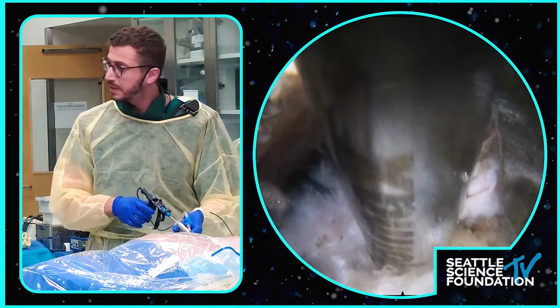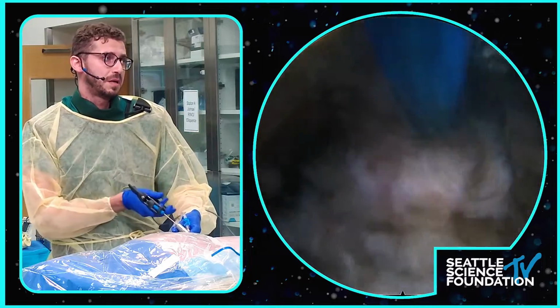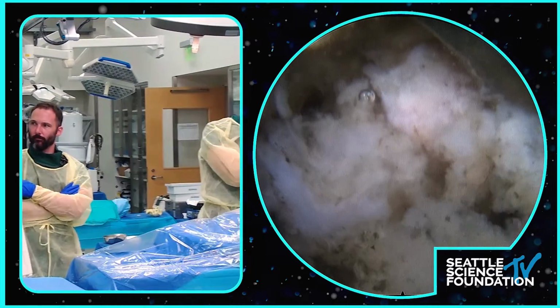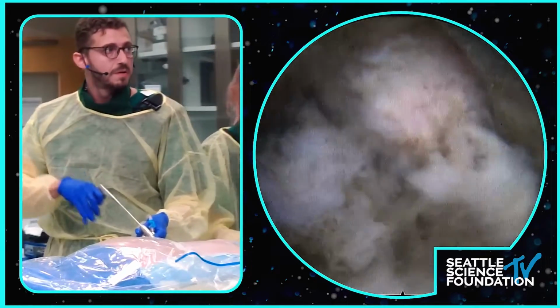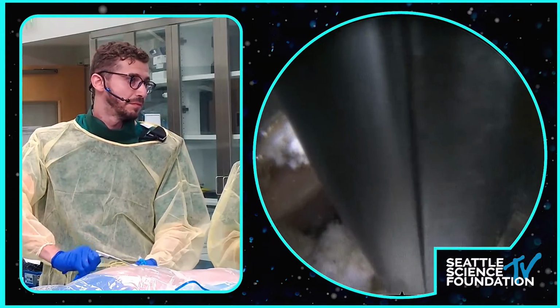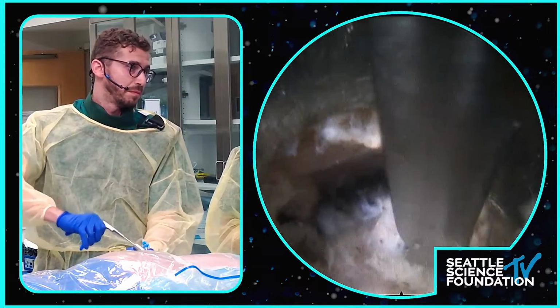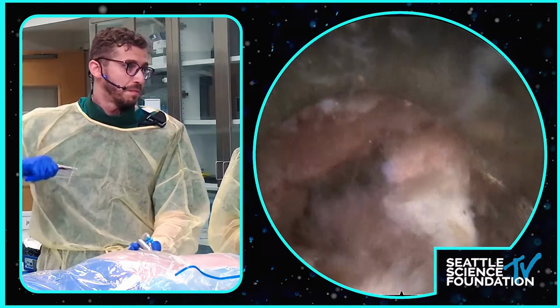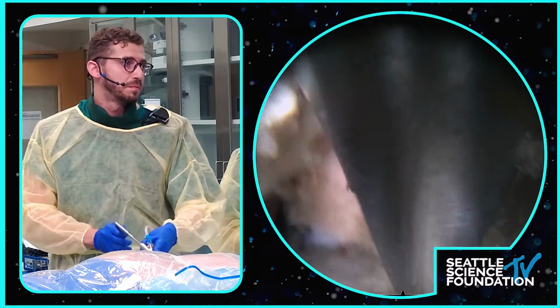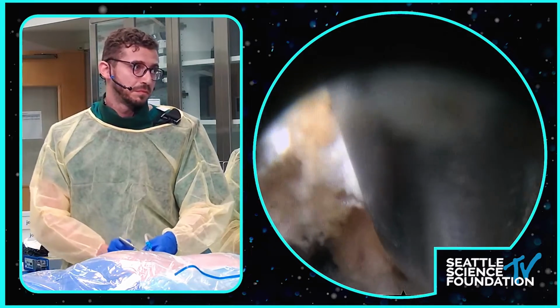What's your guys' algorithm? We have the transforaminal and the interlaminar approach to discectomy here. When do you use one or the other? Can I have Carson, please? I mean, kind of go where the pathology is. If it's paracentral or central, then I tend to favor the interlaminar, especially at L5-S1, where the iliac crest is in the way and getting into the foramen could be very tough. So that's my preferred approach. If it's central, paracentral, even up to the lateral recess, I will do interlaminar. If it's foraminal or extraforaminal, then the transforaminal makes much more sense.